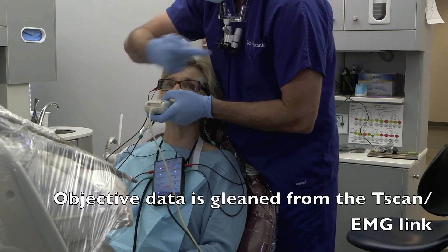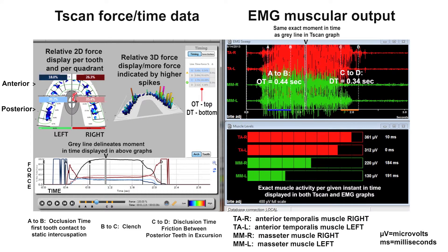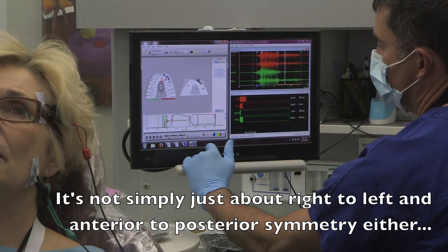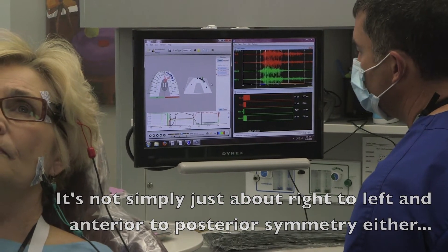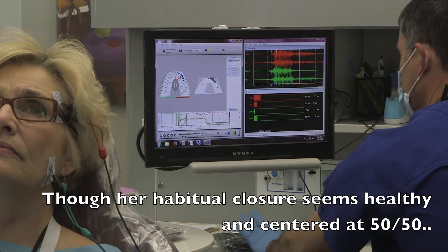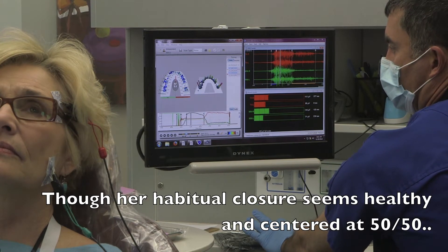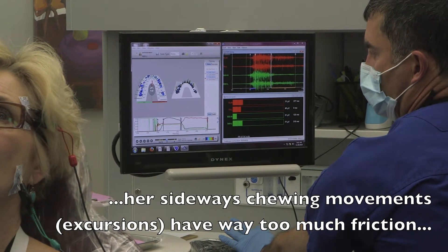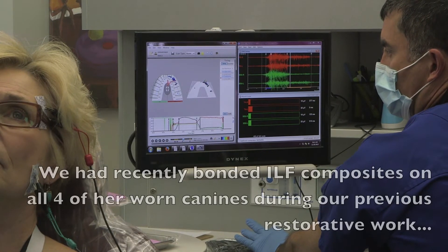Bite home hard. Now we're right to the left. And open. Beautiful. Those don't belong — see the way everything's moving to the front? Yes, this is towards your front. Here's the throat, here's the lips. Here's your right side, here's your left side. The stroke you just made was to the right, which is fine. So when you bite down, things are pretty centered — that's decent. You're actually in a pretty good place. When this little graph hits C, you're going to start running off to your right. And this should happen very quickly — it should go towards number six. And it's doing it.